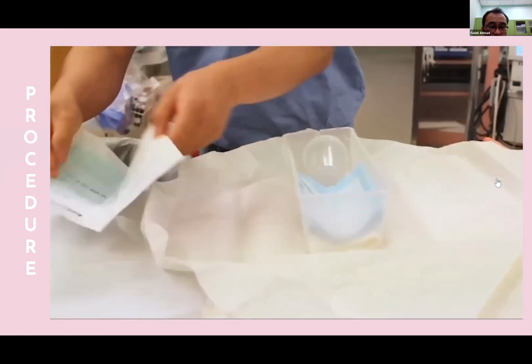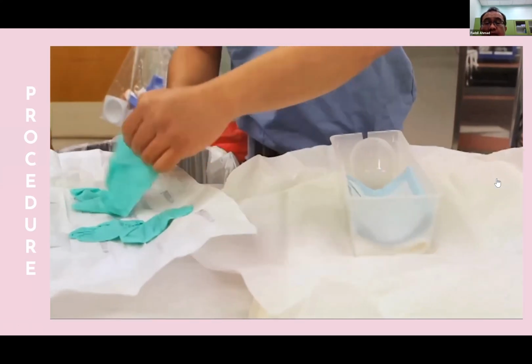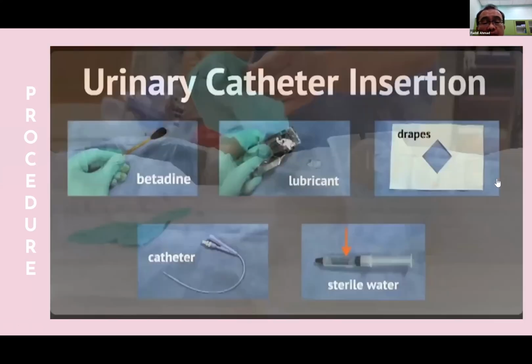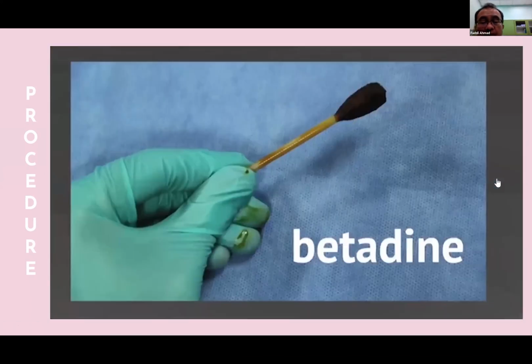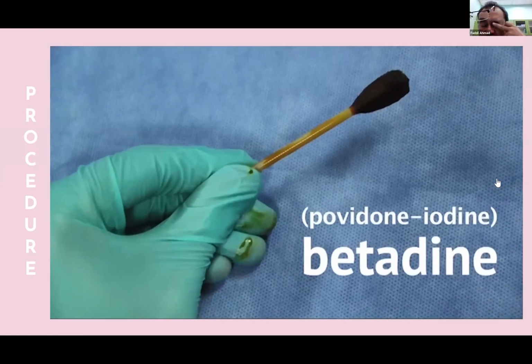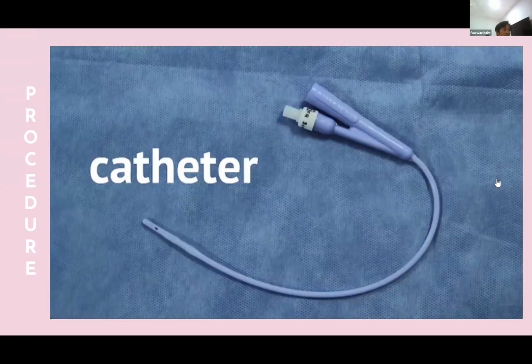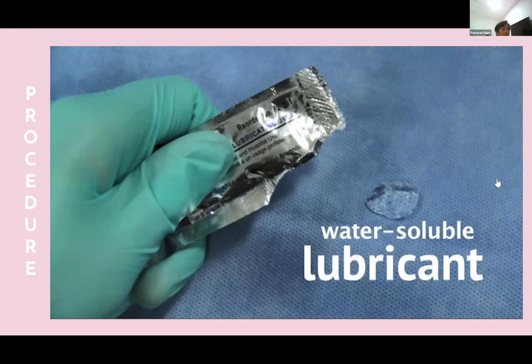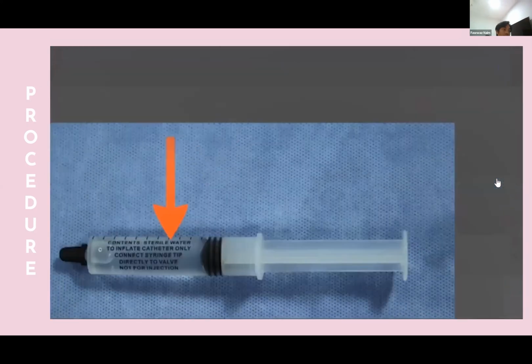A sterile field should be set up next to the patient since the catheter is inserted in sterile condition. Supplies should be gathered, and in this case, we should have betadine to provide sterility of the field, the catheter to be inserted, KY jelly as a lubricant to ensure that the catheter easily goes through the urinary tract, sterile water to inflate the Foley balloon, and finally some drapes in order to maintain sterility around the area of interest.